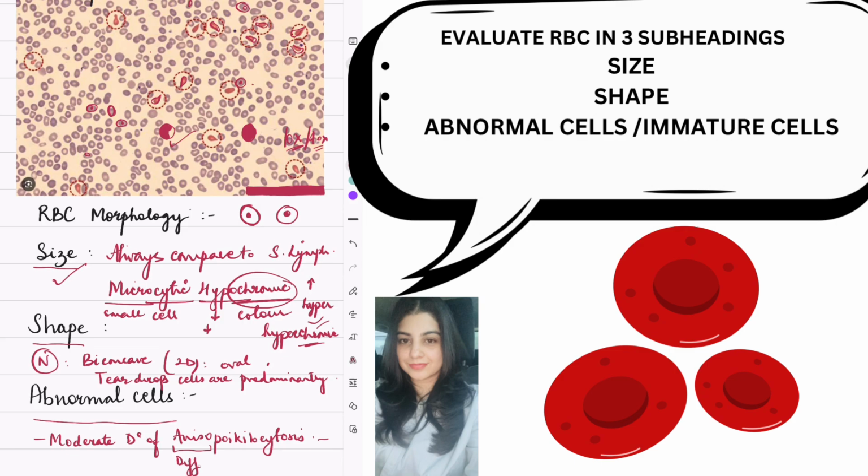Difference in the size, variation of size. And poikilo is variation in shape. I can see variation in size and I can see variation in shape. So I'll say moderate degree of anisopoikilocytosis. And in abnormal cells, I only see teardrop cells. I cannot see anything immature. RBCs are mature with the central pallor.